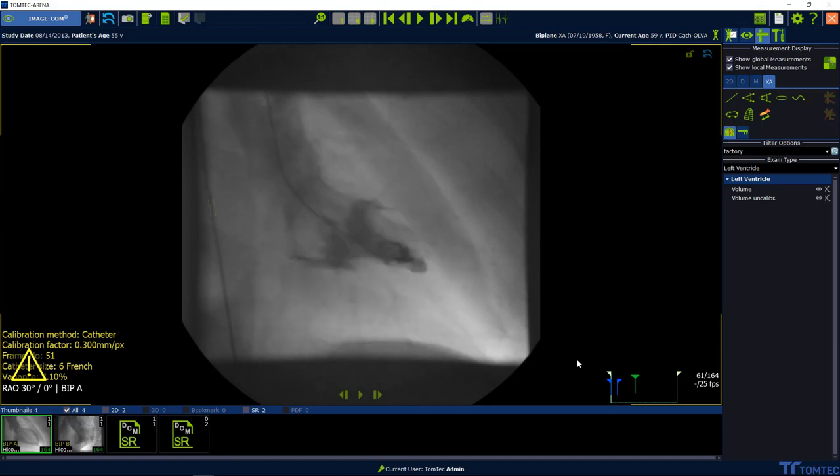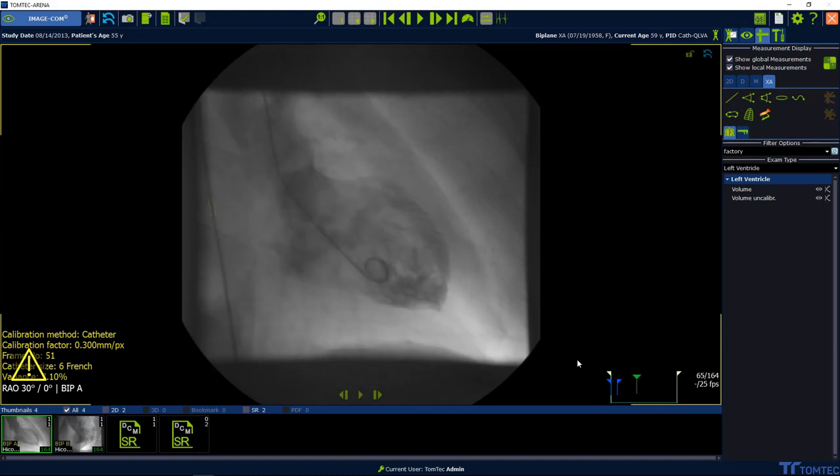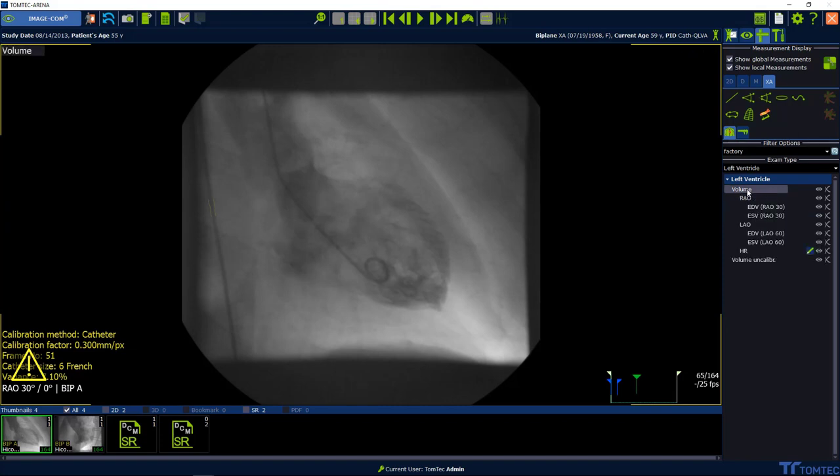To perform the measurement, select the frame with a high level of contrast by using the next frame or previous frame button, as well as scrolling and using the mouse wheel.